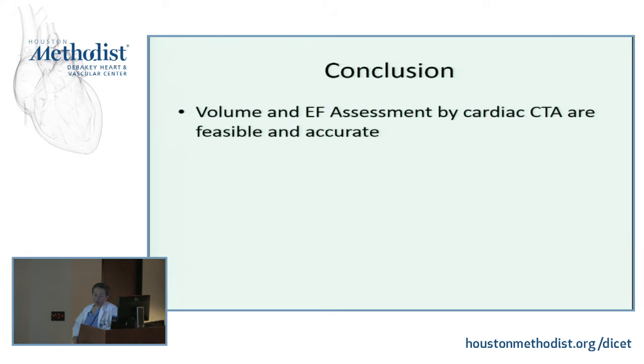Specifically, right now we're doing a lot of valvular function assessment, which often requires information from different parts of the cardiac cycle, and you will get the LV function, so you need to know how to quantify and assess it. Next time we can talk in more detail about what kinds of factors affect the measurement of volume and EF. That's all I have.